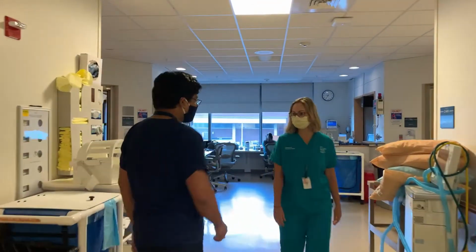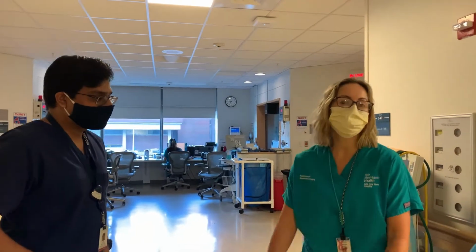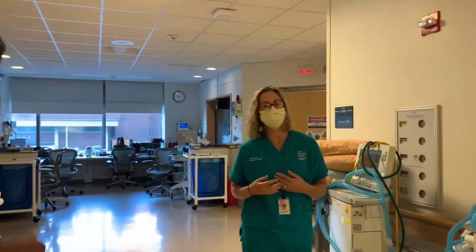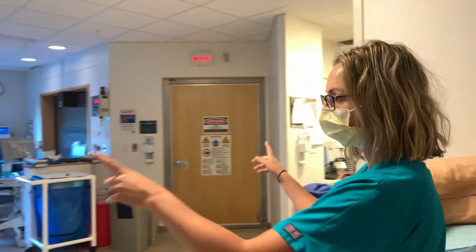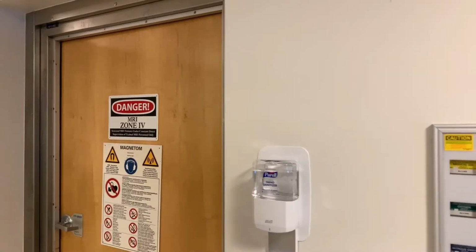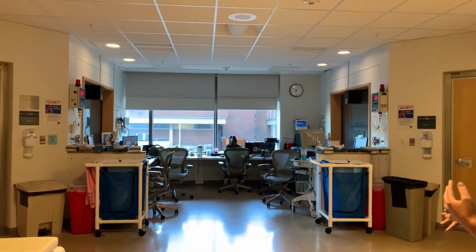Hi, how are you? Good. Want to introduce yourself? So, my name is Marie Hausner. I'm the safety lead for MRI. This is the main Smilow area in North Pavilion. If you want to take a few steps closer. These two rooms by the windows are both 3 Tesla. And the room to the left of you is the 1.5 Tesla. The whole hospital is all Siemens, and this is the area where we do all the Smilow inpatients.